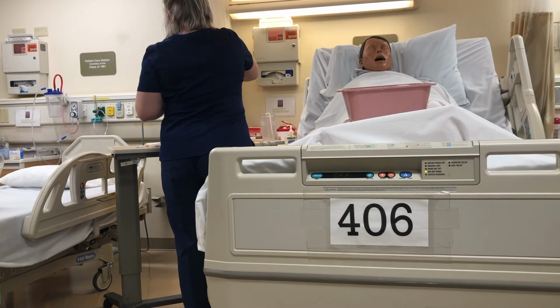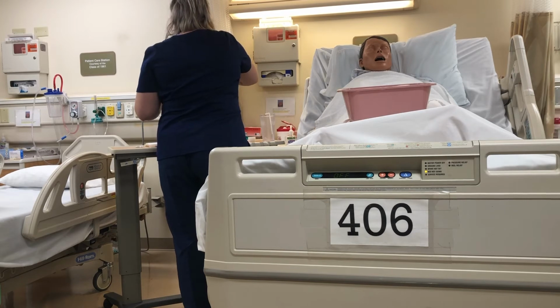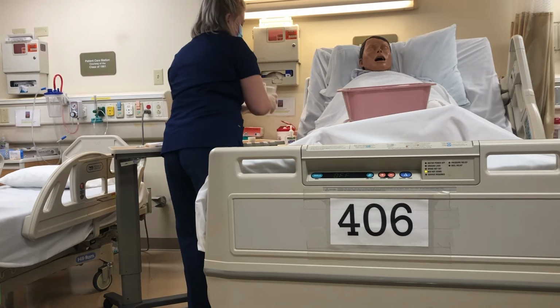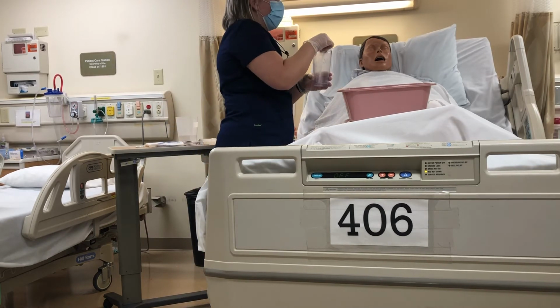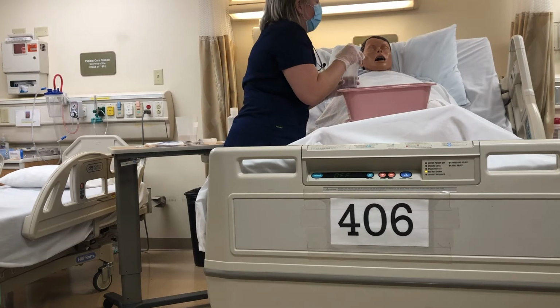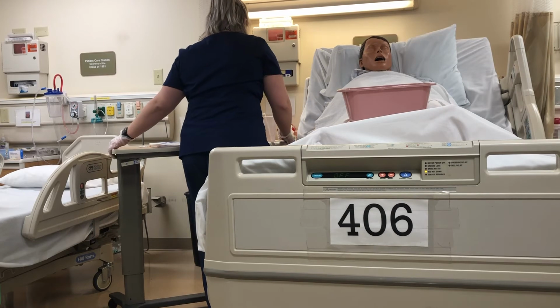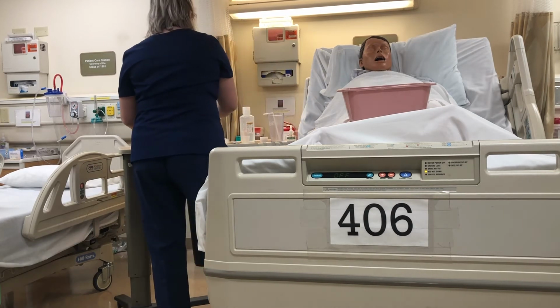Alrighty, so I'm going to pour some of this sterile water over here, and I'm just going to get my workstation all set up. I have some water here for you that I might offer you while I'm placing the tube, and that might help you get the tube down and in place. So we will be sure to use that.